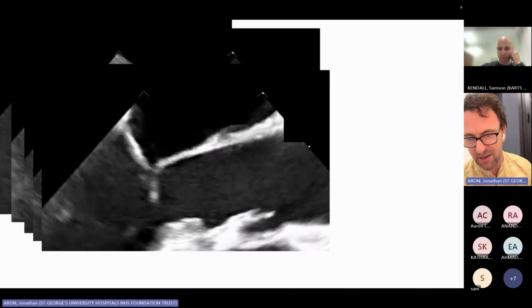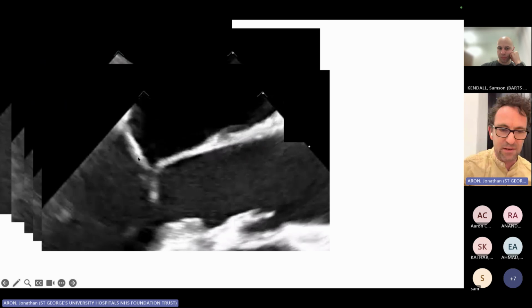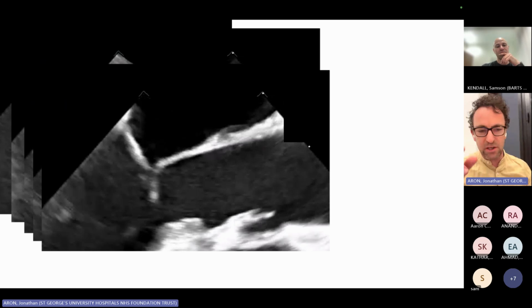Oh, well, that's actually not great, because that mitral valve seems to be now obstructing 2/3 of the left ventricular outflow tract. So here, this is the posterior leaflet, this is the anterior leaflet. Blood is now only able to eject out of the heart through this very, very small narrow opening here. Now the aortic valve, you can see, has started to almost stutter a bit. And if you were to play the video back really slowly, you could see the aortic valve fluttering.